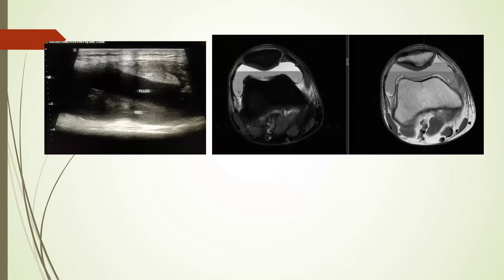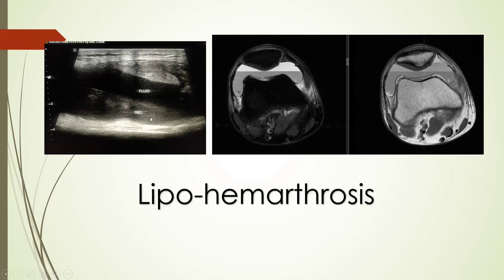We can also see lipohemarthrosis on ultrasound, where fat is lighter than fluid and blood so it floats in the anterior non-dependent region, then comes the fluid, then the blood. Lipohemarthrosis develops when there is a fracture that communicates with the articular surface.